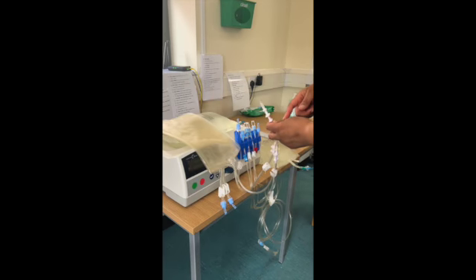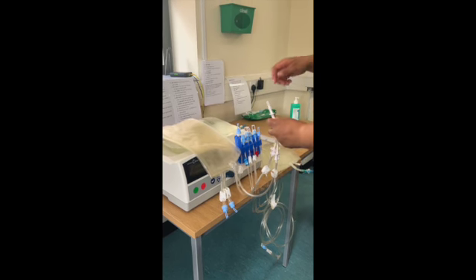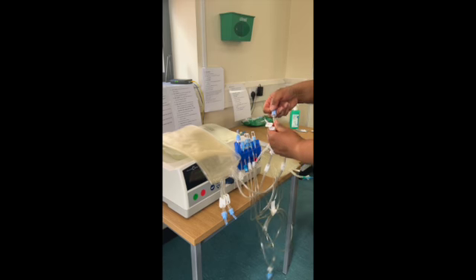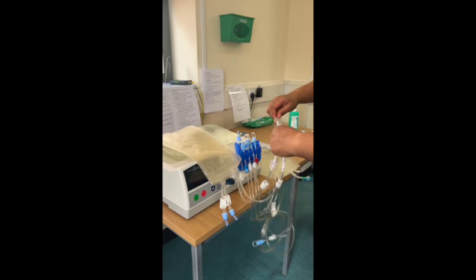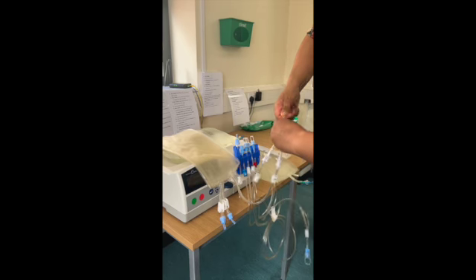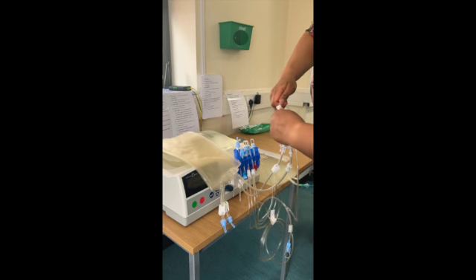I'm now going to connect the manifold to the first line, which is on the right, which is the drain line. Again, being careful not to touch any of these. Make sure you push it all the way on, and just being really careful not to touch below and risk infection.